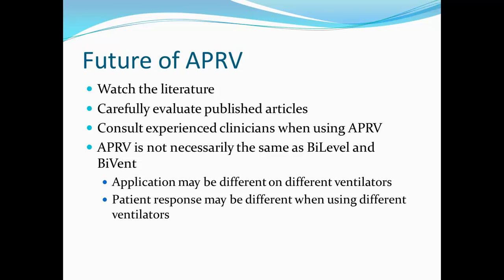Evaluate the published articles and see if the article that was published is a reasonable article, and if it recommends therapy and treatment that is appropriate for you and for your patients. If you're going to start using APRV, consult with an experienced clinician first.